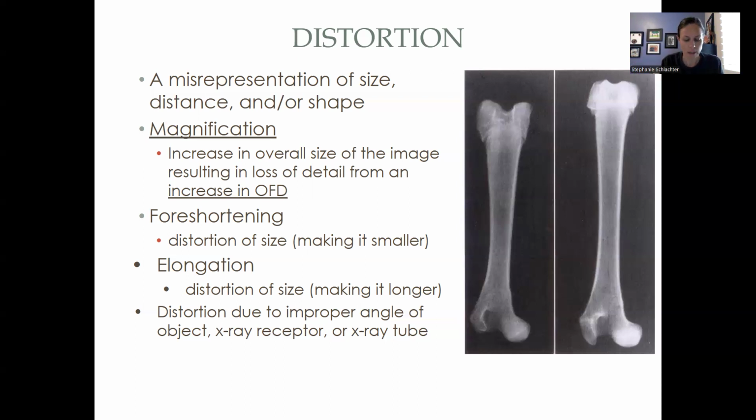Magnification, I think I talked about it last week, but magnification I can use to my advantage. If you think about your teeny tiny patients, like your mice and your rats and a lot of your exotics, they're small, right? And so seeing an image that's this big on the screen, I might not see everything. Now, if I take that patient and put them up on a box that's radiolucent, where the x-rays can still go through, now I've just made them bigger so I can actually see things better. Okay, so I can use magnification to my advantage in some cases as well.